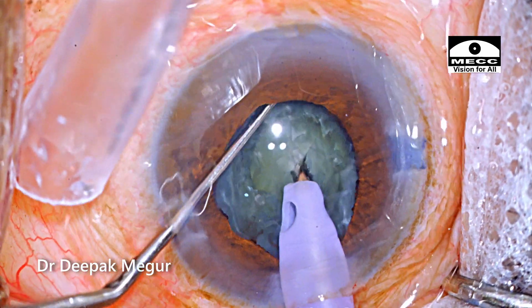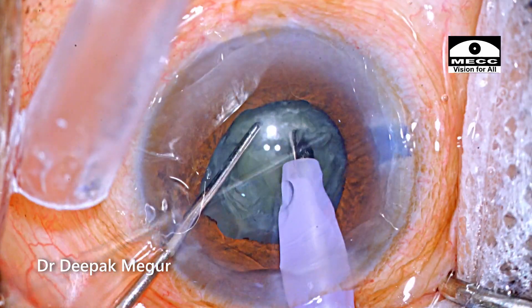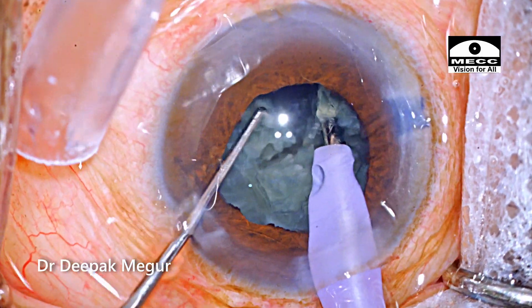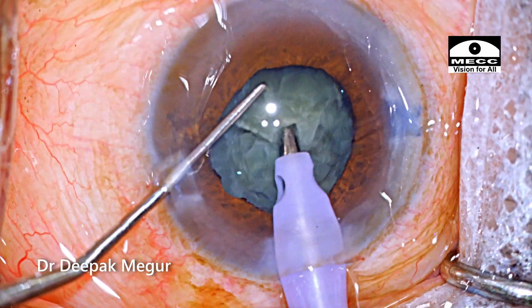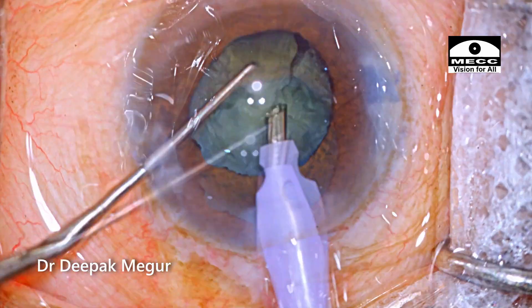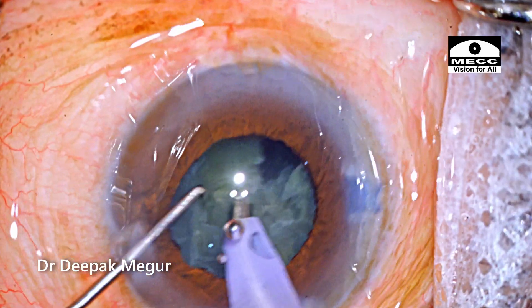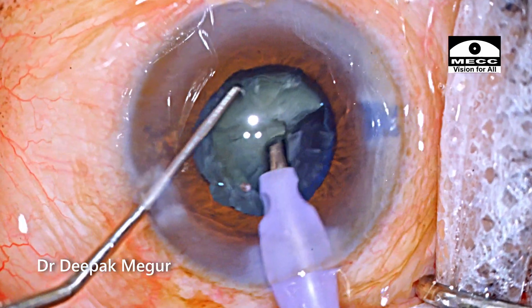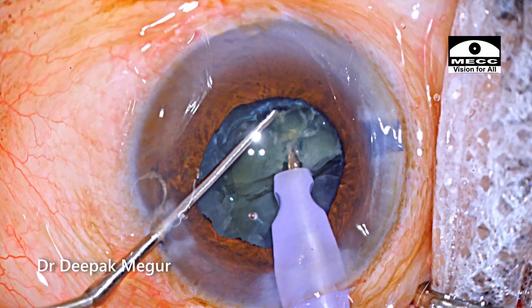The nucleus is around grade 2 or even lesser than that, so chopping is not going to be very difficult at all. We don't have to bury the tip deep in — just by holding it a little bit we can immediately score and divide it quite easily. Once the first hemi-nucleus is divided, I'm going to change the settings to quadrant removal mode and remove these fragments out of the bag and emulsify them. Subsequently, the second hemi-nucleus is divided into smaller fragments and all the fragments are then emulsified.